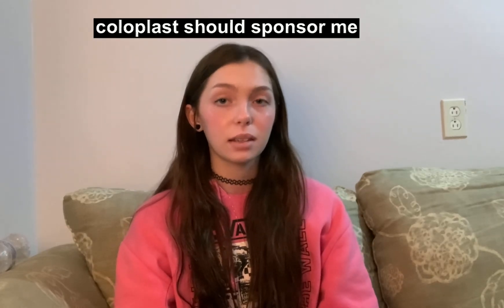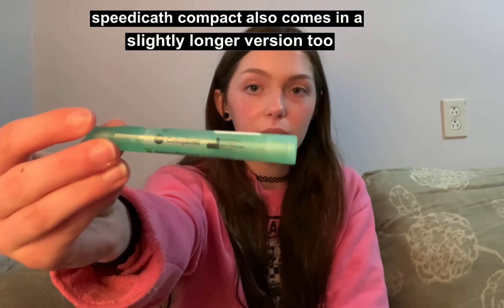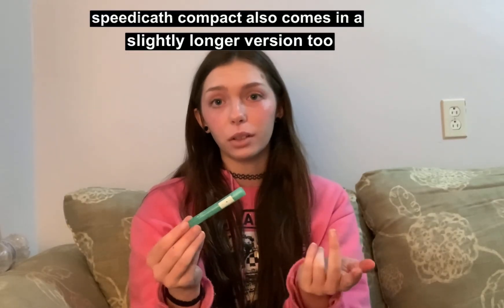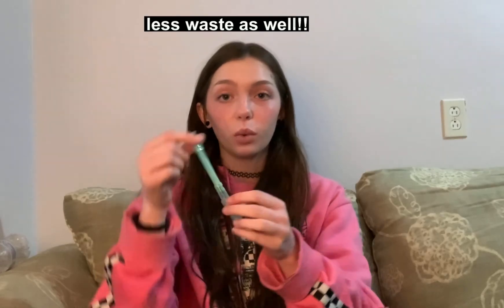The second catheter I ordered is called Speedy Cath Compact, also made by Coloplast, but this one isn't a set — it doesn't come with the bag, just the tube. It's really small and discreet, probably smaller than a tampon. You just untwist this one too. Same thing applies: if you open it the wrong way, the water lubrication will leak, and with this one it will definitely leak, so you have to open it upside down.